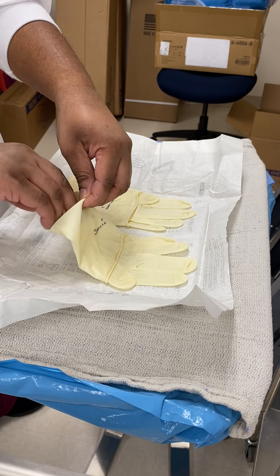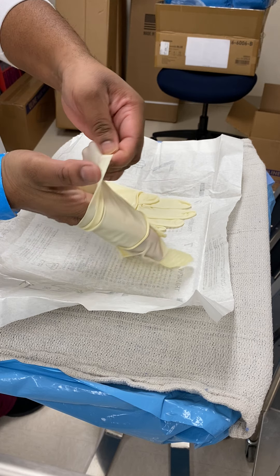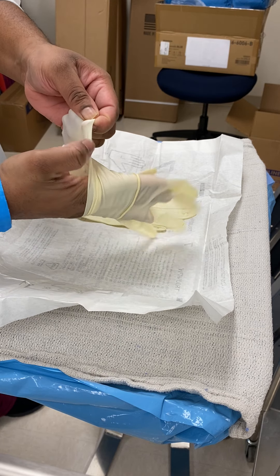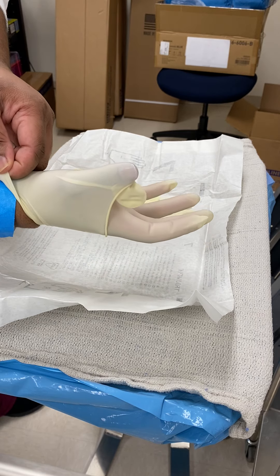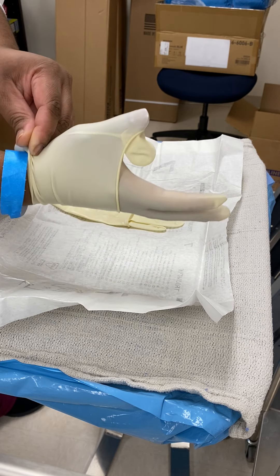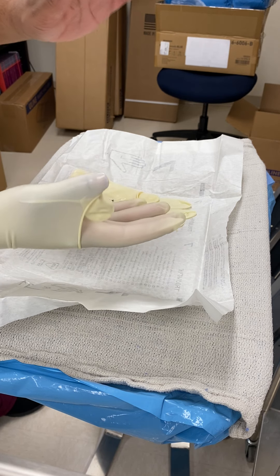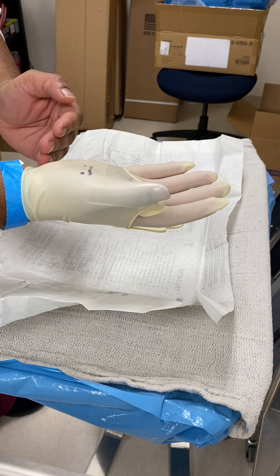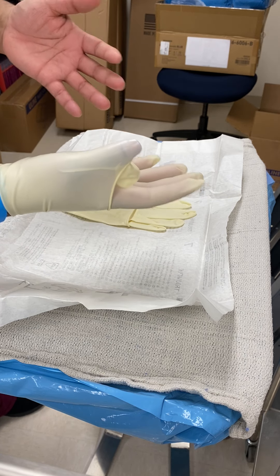What they mean is you're going in and sliding your fingers in. You can see my hand is still with the cuff and I'm going in until my thumb is clipped, and then you let go. Your bare left hand should only touch the folded part of the cuff — the rest of the glove remains sterile.